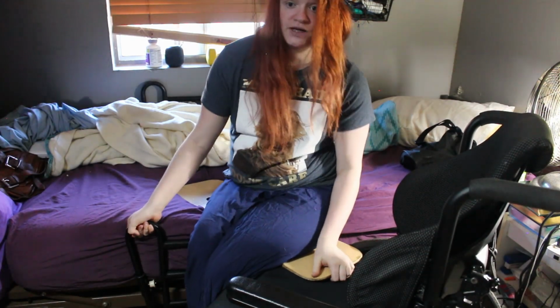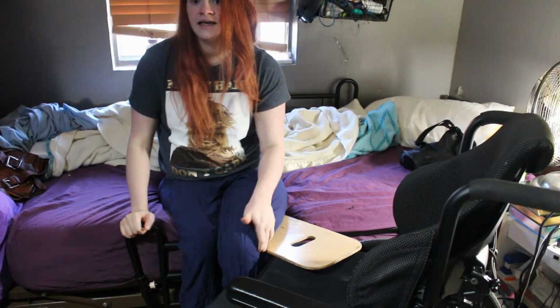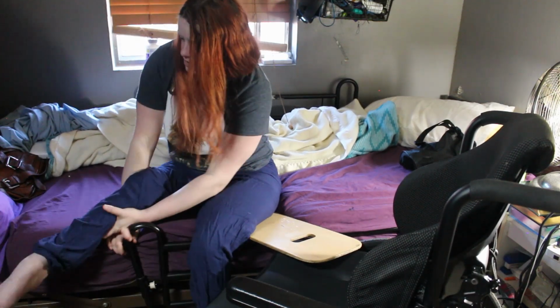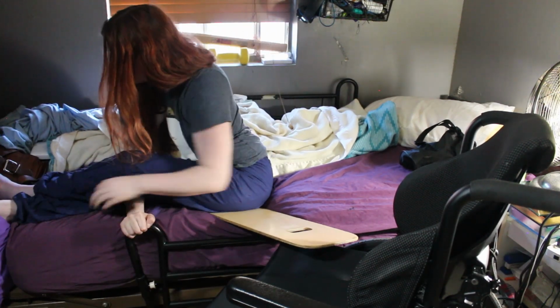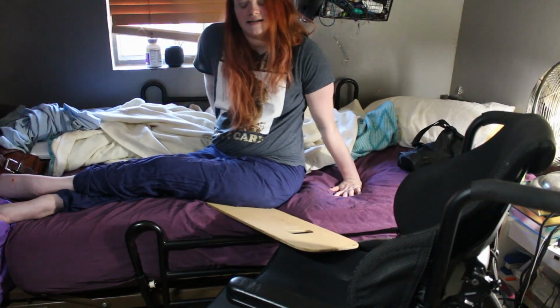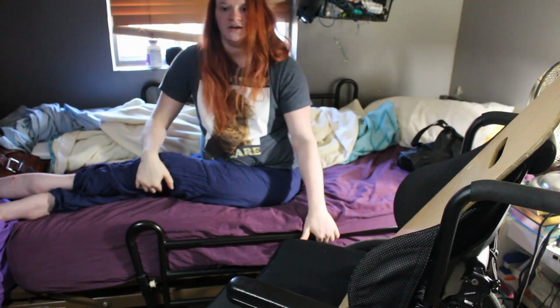I grab my hospital rail because I still use a hospital bed. And then I slide over like this. So, once I'm in, I pretty much put my leg in the bed. And then we do the other leg, and then we scoot, and we're in. But then what we do is we slide this guy out. So, that's how I get in.